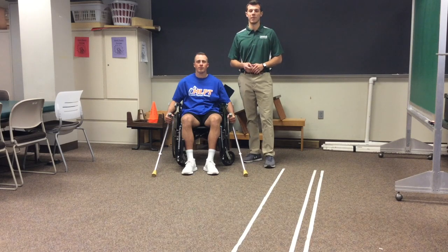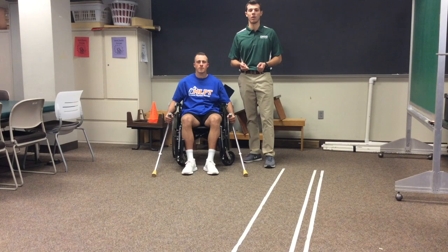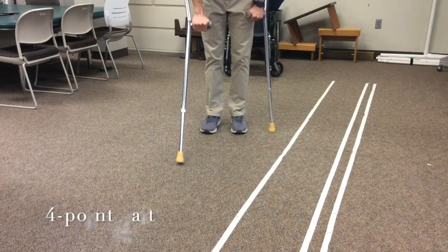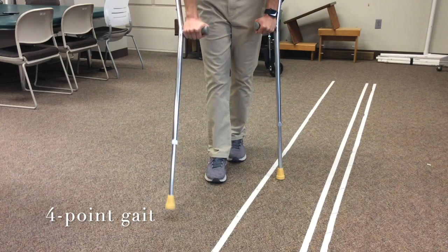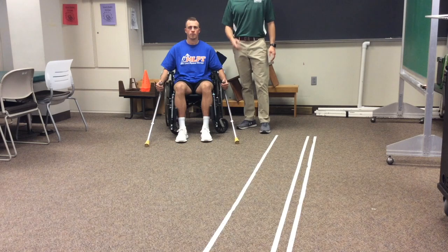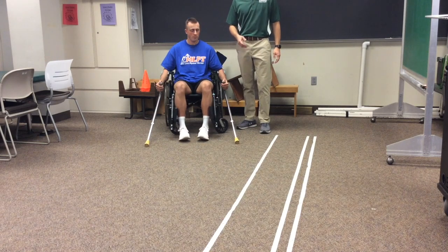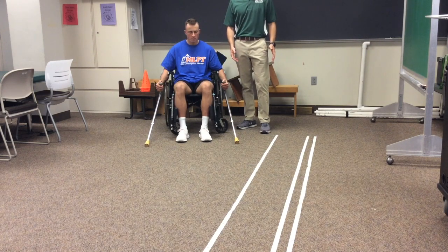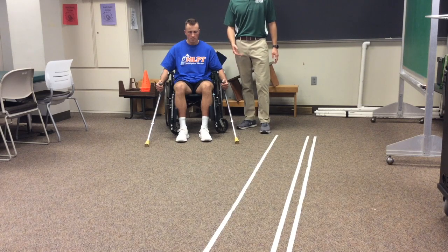For the four-point gait pattern, you're going to maintain three points of contact with the ground at all times, providing the most stability. The two-point gait pattern should be utilized when the patient can demonstrate full weight bearing on both lower limbs. This most closely resembles normal walking and the crutches are mainly there just for assistance. I'll demonstrate that for you now.